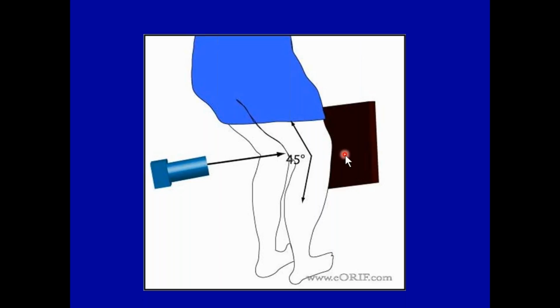So when you're at lunch with some of your colleagues or chiropractic assistant friends, after you talk about everything that you're interested in, ask them, okay, what is it that you've come up with for your AP view examination of the knee? The lateral is fairly easy. We talked about that earlier, just having to stand aside, and most people can bend their knee unless there's an awful lot of pain. If they're in a lot of pain, just say, all right, just relax for a minute, you get yourself ready, and then at the moment before you're ready to shoot, just say, all right, I want you to bend your leg like this, show them, and then you're ready to take the X-ray.